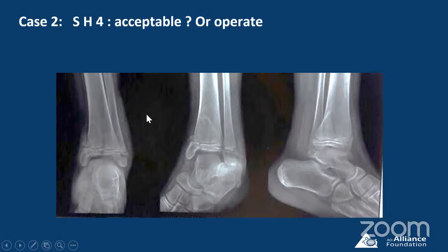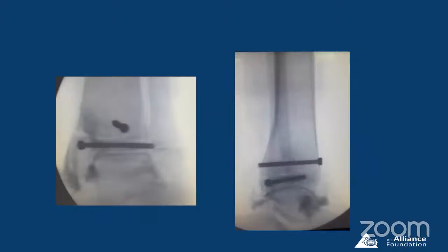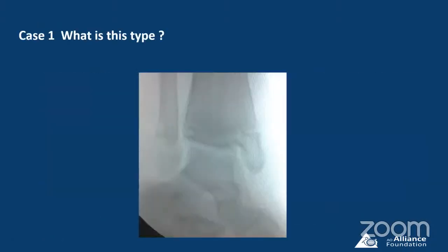Okay, Salter Harris 4 needs accurate reduction, additional imaging. You can see here on the CT scan, it demonstrates the amount of comminution and crushing of bone, especially in the growing end. So you must counsel the family again, additional imaging as required. And a transverse screw is what is recommended. Now, this was a triplane, so there's a metaphyseal AP screw also, but this is a closed procedure. You can see the arthrogram, you can see the talus, you can see the articular alignment and the transverse intraepiphyseal screw to hold the reduction. And that is how it heals and that is what should be done.